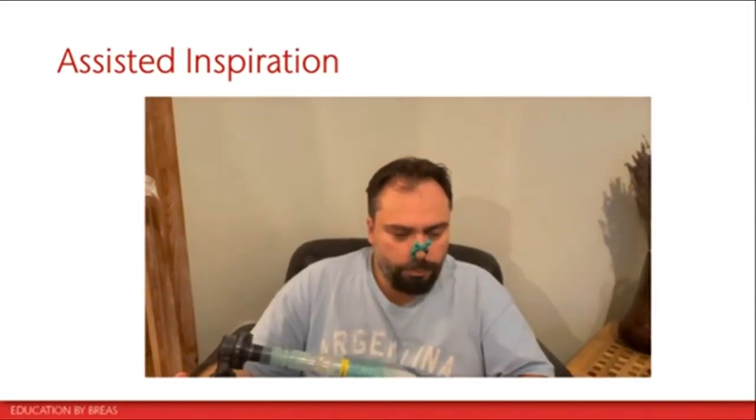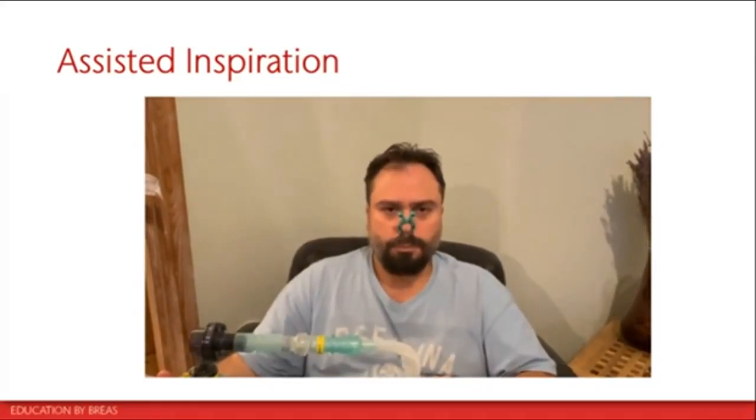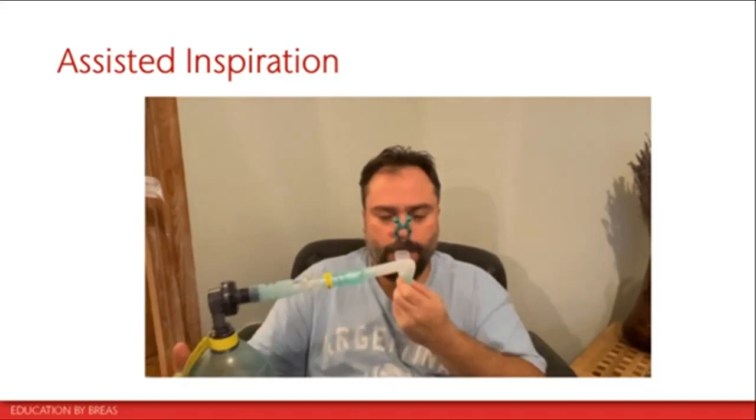Okay, I'd like you to repeat the procedure without my instructions, and instead of just breathing out, cough when you take the mouthpiece out.